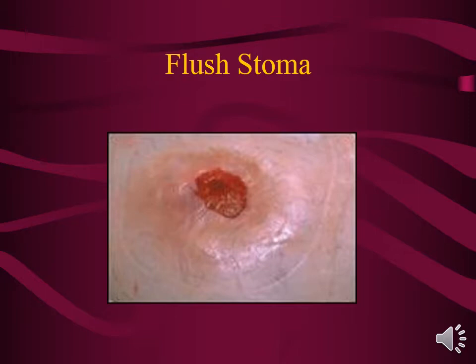And then if they can't, there is something called a lavage technique where we use a syringe to gently put some water in there and coax that food particle out. But it's not the same thing as irrigation.